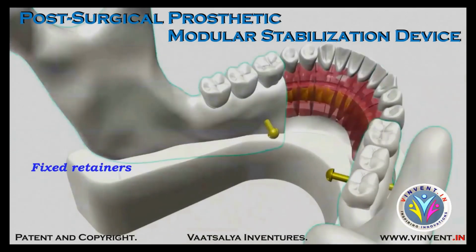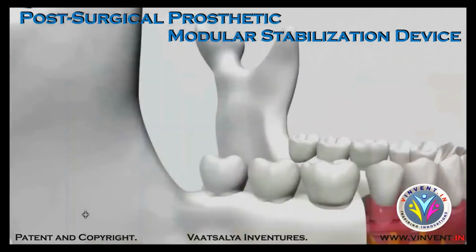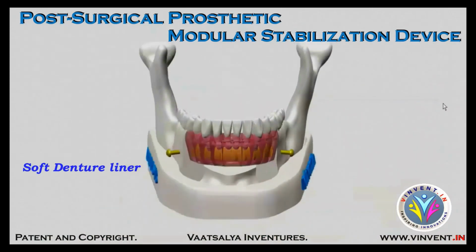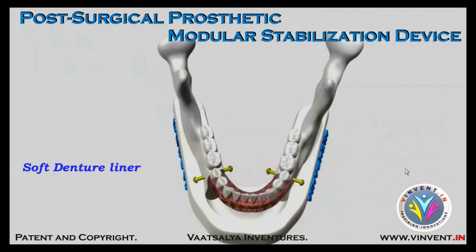Further, teeth components can also be secured by use of fixed orthodontic wire retainers on the lingual surface by bonding with composite resins. The lower portion and gaps between soft tissue components can be sealed by use of soft denture liner material, which can be molded by labial movements and tongue movements.